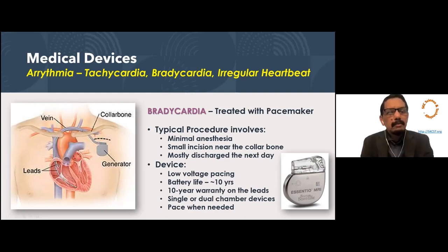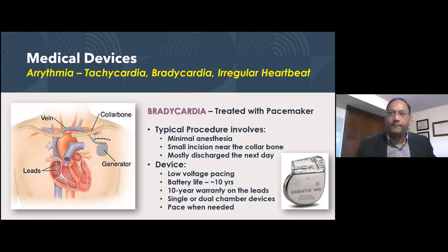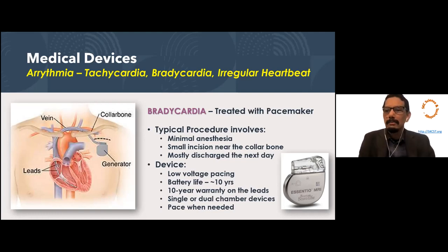So here's one question, what I understand, the way you need to regulate it could be different from one person to another, right? I've heard that more recently, you have the ability to have some wireless way to do it from outside. In fact, one of my friends has these devices. Can you talk about it? Unless you're going to talk about that later.